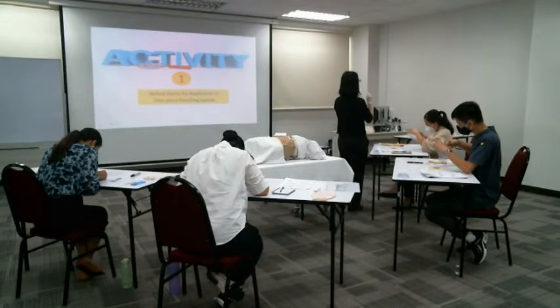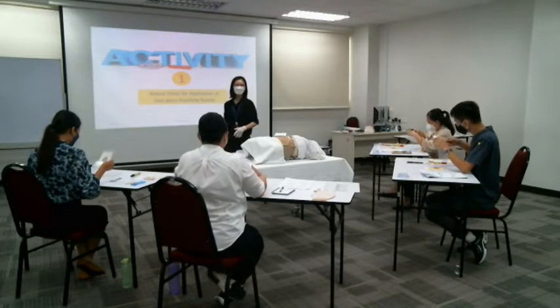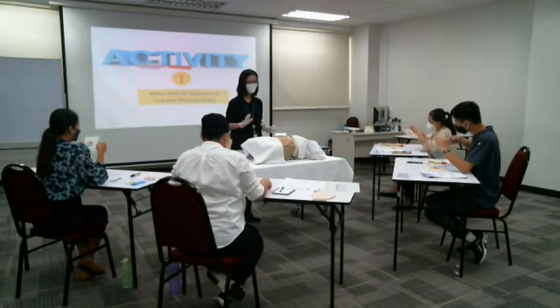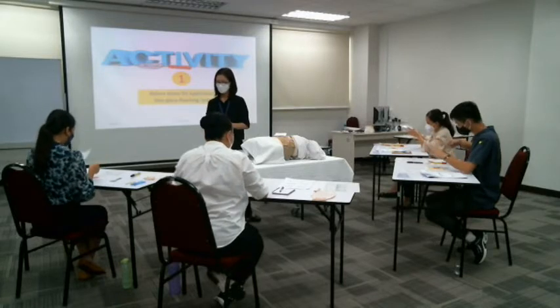Remember, before you put the arrow, you have to decide, if the patient can walk, then you put it this way. Okay, put it so that it hangs down. The patient's walking. If the patient cannot walk, then you put it sideways. Alright?